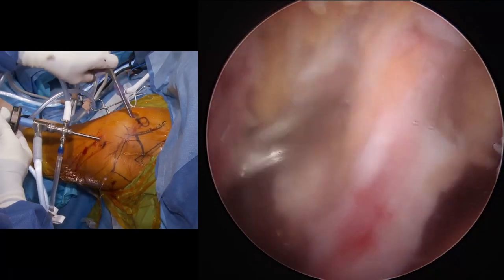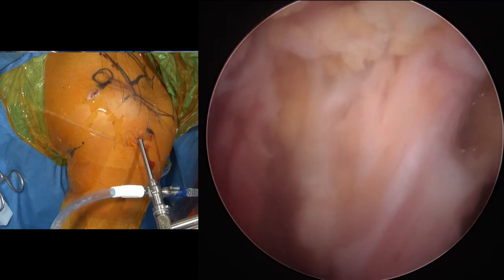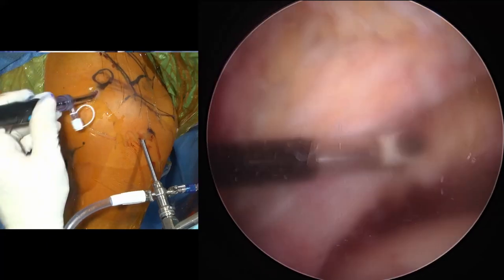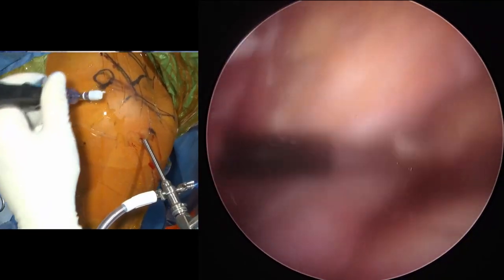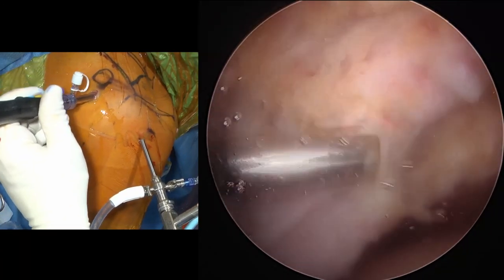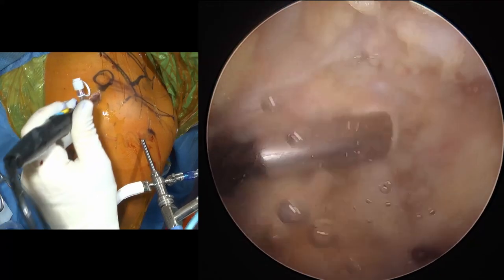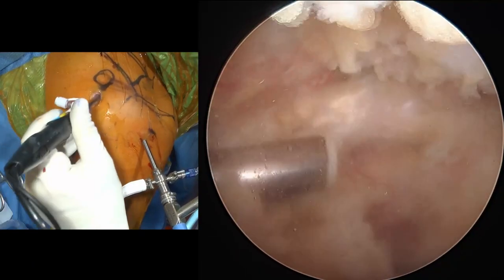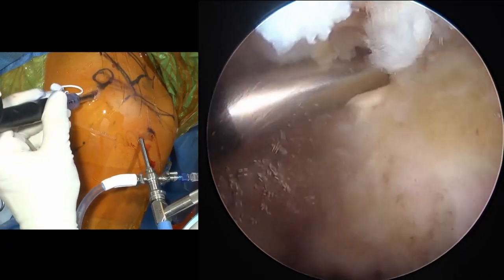I've already loosened him up a little bit here. Let's have the Arthrocare again. Give me that back. Yep. I'm going to have to split this rotator interval a little bit here. Let's see where the supra lives and dies. So the coracoid's there. It's got to come through here. So we have a thickening of this tissue anteriorly, and this is kind of restricting us. So we're going to have to do a split between his rotator interval so I can move the tissue over far enough to get a surgical repair. That's his coracoid process. And that should get the anterior edge of his supraspinatus to move a little better for us.